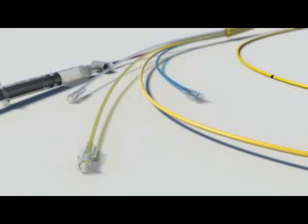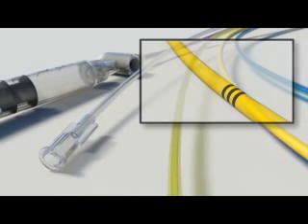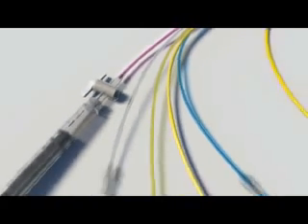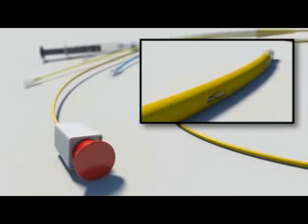Some catheters contain an additional port, usually clear or white, that connects to a second lumen 30 centimeters from the catheter tip and may be used for infusions. A pink or red port is used to inflate the balloon at the catheter tip. Use only the syringe packaged with the catheter, as it fills only to the balloon's capacity. When fully inflated, the balloon should completely encircle the tip of the catheter, which reduces mechanical trauma during insertion. It is essential that the balloon be inflated whenever the catheter is advanced and then deflated whenever the catheter is withdrawn. The final port is connected to a thermistor near the catheter tip and can be connected to a computer for measurement of cardiac output by thermodilution.